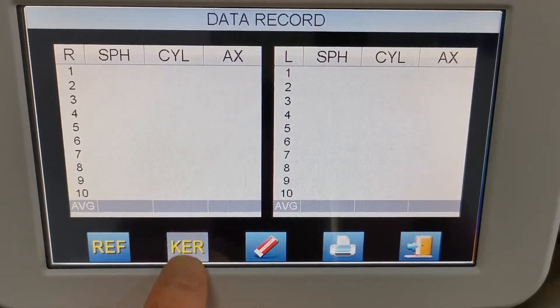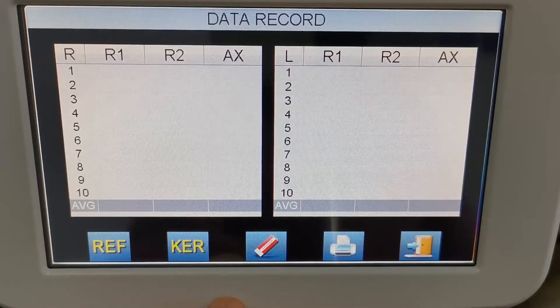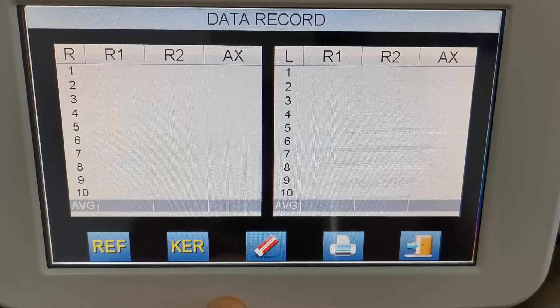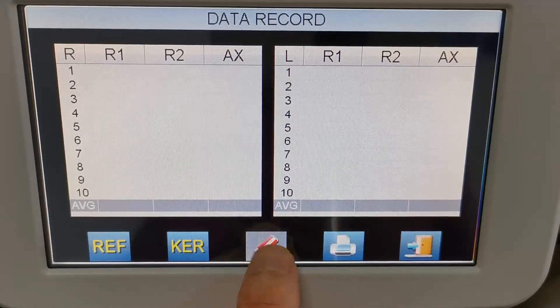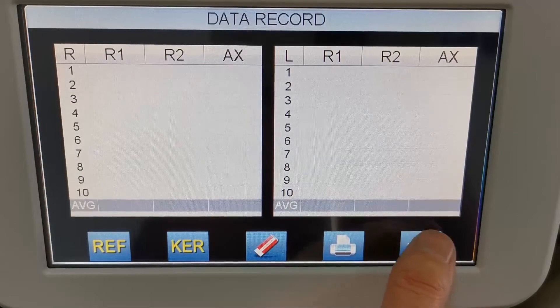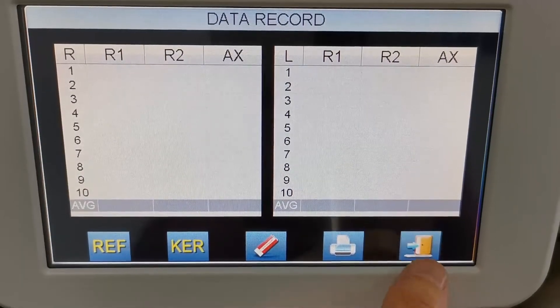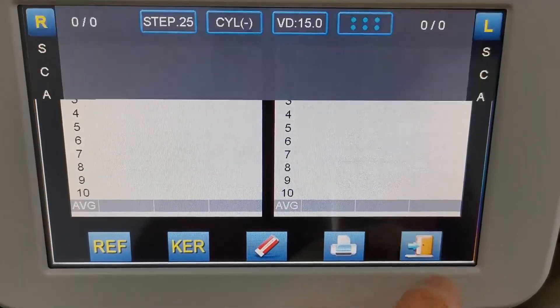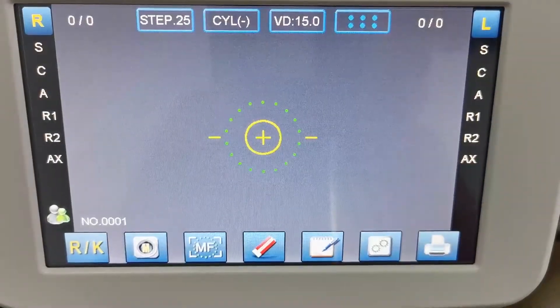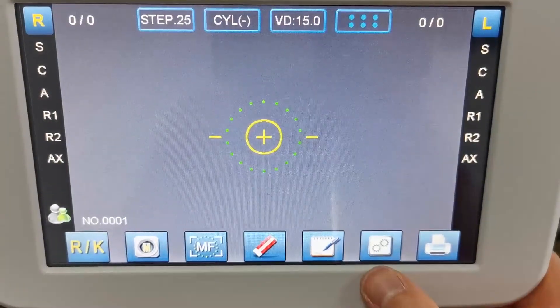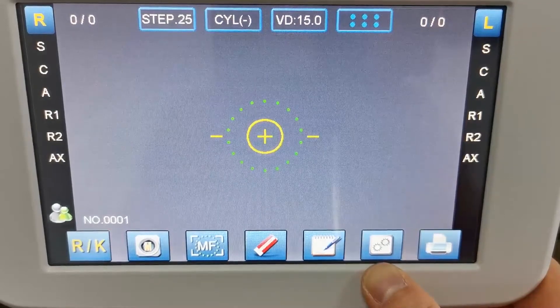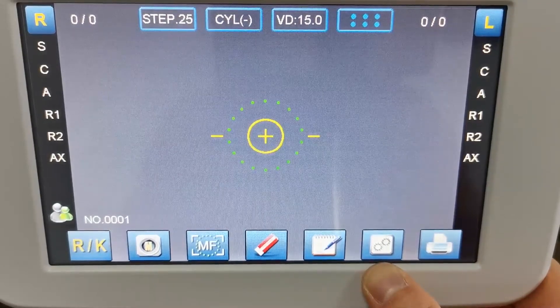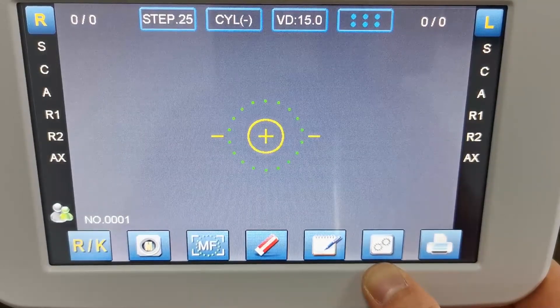And you can check the keratometer mode here as well. Here is the setting menu to set all kinds of parameters.